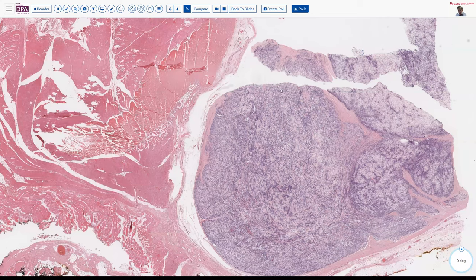If you find even those small areas. Now, if you didn't find convincing neoplastic bone in the lesion, then I suppose that a more descriptive diagnosis like that would be possible.